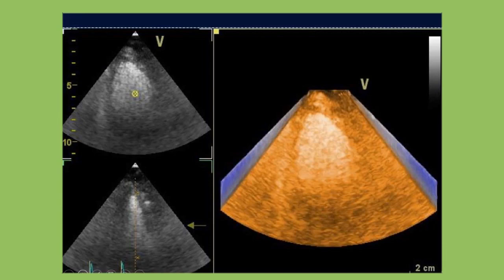When I started at Cleveland Clinic and was writing the imaging protocol there, we thought that if 3D echocardiography was good, and if I could use contrast, I would potentially be in a situation where I could have calculation of volumes and ejection fraction pretty similar to what MRI could furnish me.